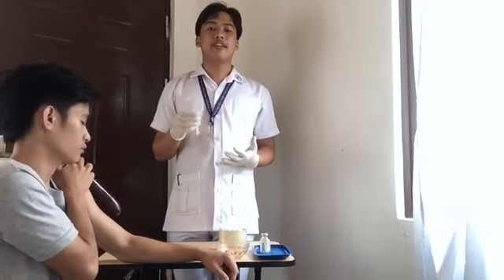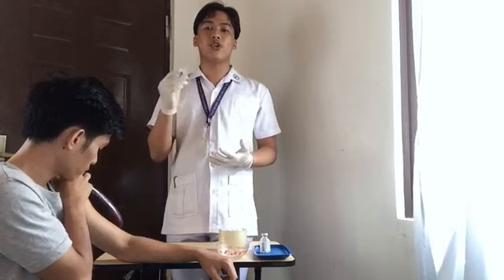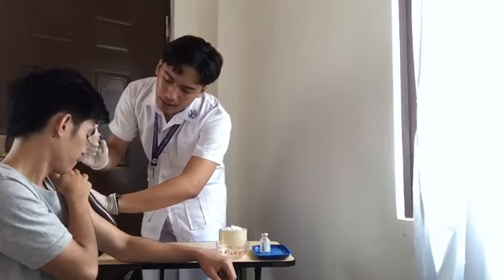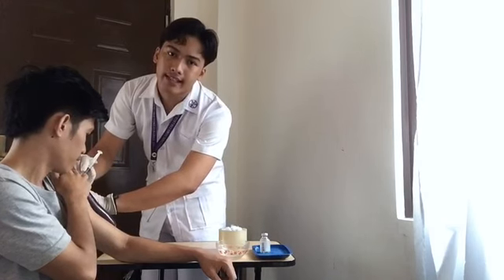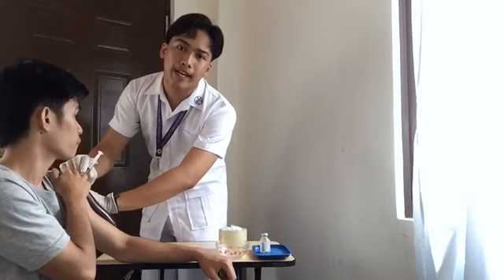So next is inject the medication using the Z-Track technique. So, holding the syringe between the thumb and forefinger as if you're holding a pen, pierce the skin quickly and smoothly at a 90-degree angle. So, I am going to inject it. And next is hold the barrel of the syringe steady with your non-dominant hand and aspirate by pulling back on the plunger with your dominant hand. Aspirate for 5 to 10 seconds.